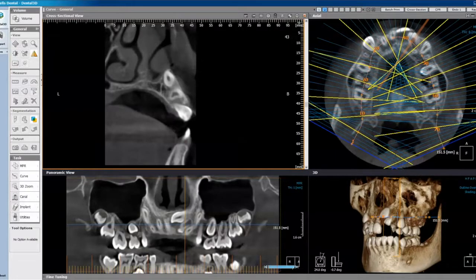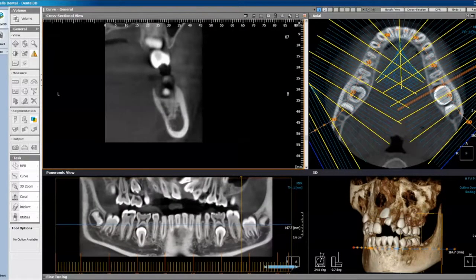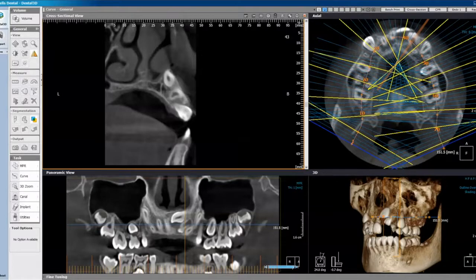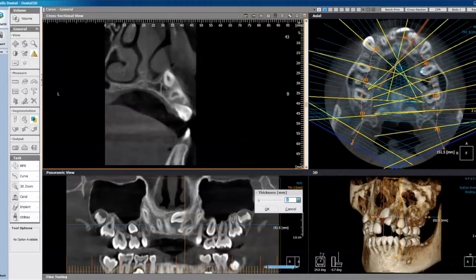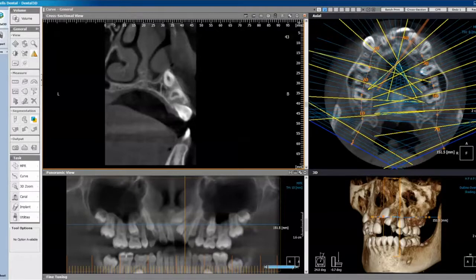You'll notice that at the top of the toolbar a number two has been generated in a box, and that allows me to toggle back to my first project which was along the mandibular arch and toggle to the maxillary panoramic curve that I created. I can also change the thickness of this panoramic curve by clicking down here — usually picking the 15 or 20 millimeter thickness — which creates a more similar panorex to what we're accustomed to.